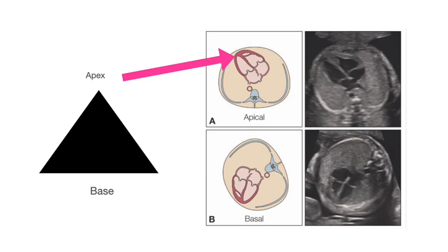So in this picture at right, if the beam is coming in from the apex, I guess it would have been more accurate if the apex was the thing that was in the front there, but it's close. The basal is a little closer to being perpendicular, so that's a nice shot down there. But anyway, when you come in by way of the atria, we call it basal, and if you come in by way of the ventricles, we call it apical.